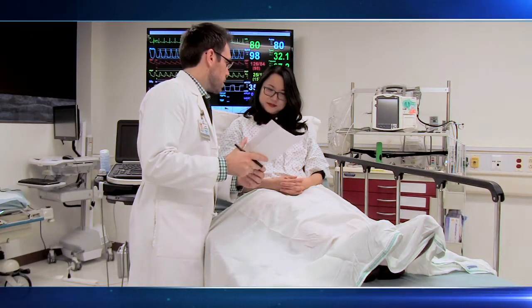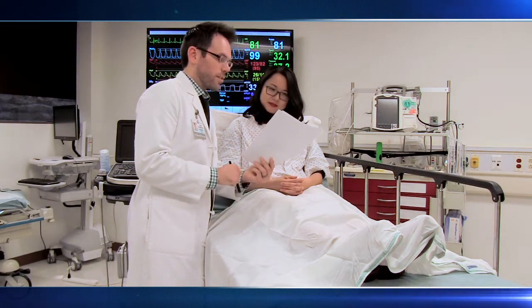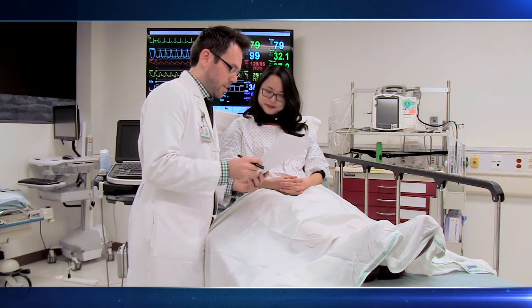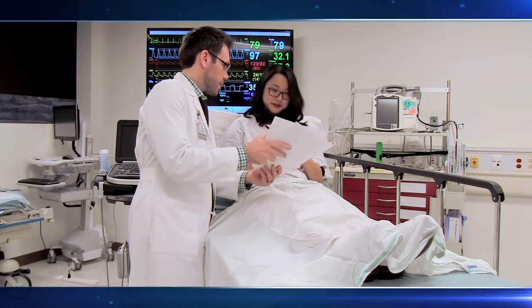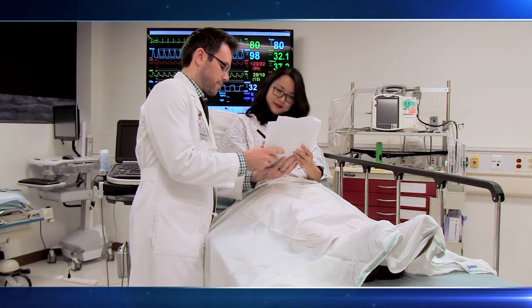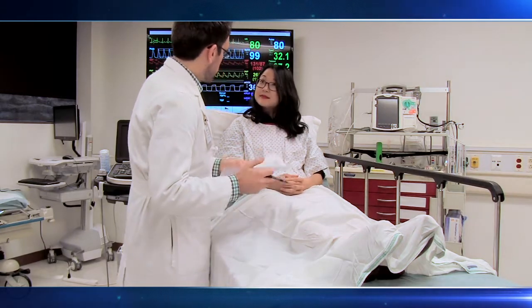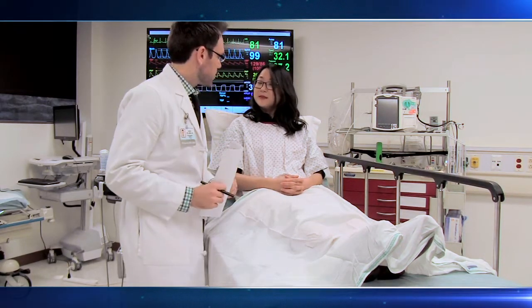The first step to place an arterial line, as with most invasive procedures, is to obtain and document informed consent from the patient or designated medical decision maker. Then perform a procedure timeout to confirm the patient, location, and the procedure, as well as the allergies and relevant medications, such as antiplatelets and anticoagulants, as well as labs like INR and platelets, and review previous arterial imaging of the extremity to rule out significant vascular disease.